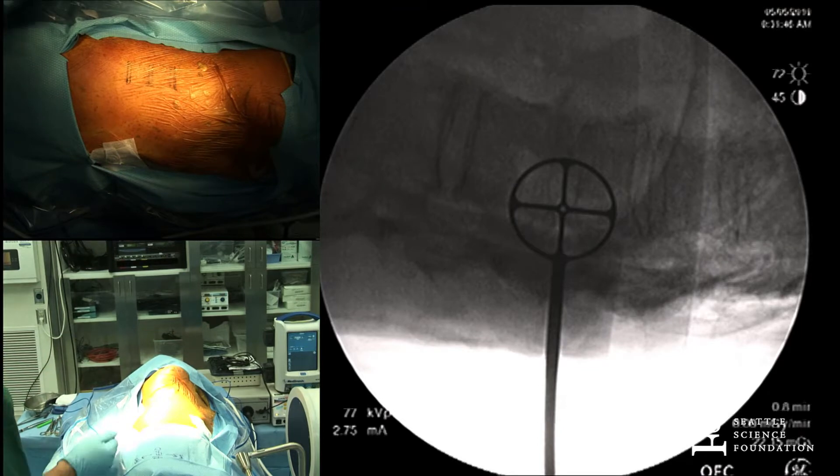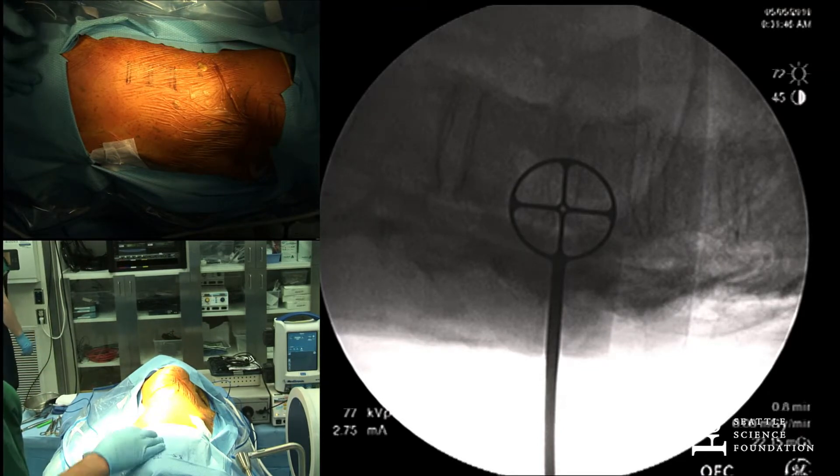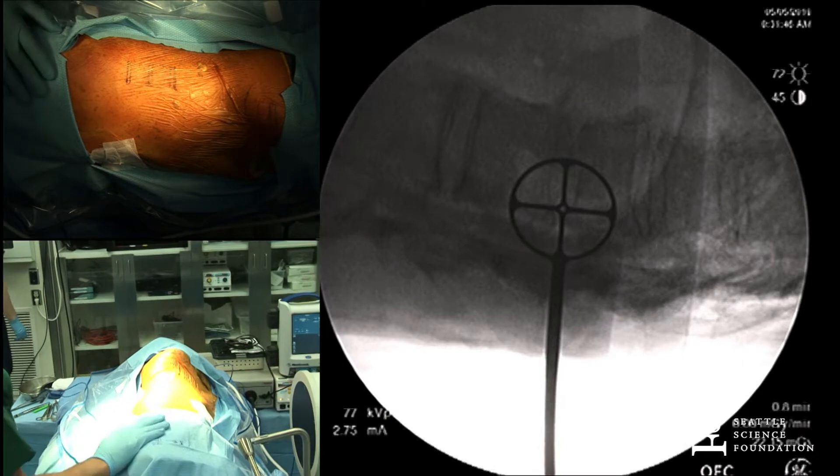We're going to try to go and do a lateral thoracic approach, and I'm going to try to show you guys how to go retro-pleural and stay out of the chest cavity.